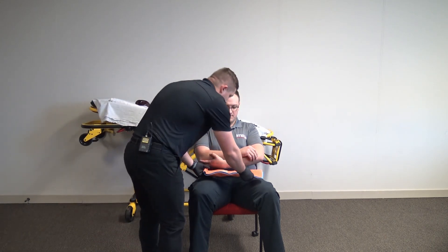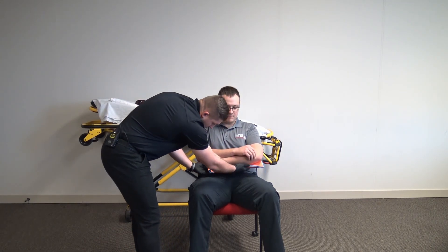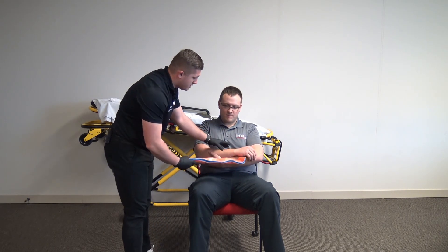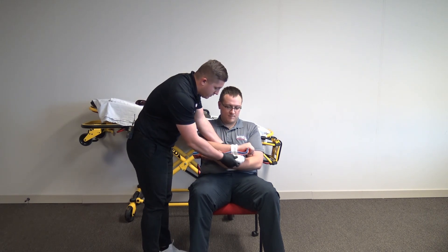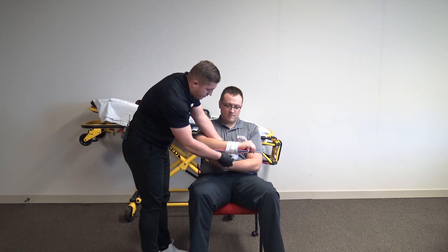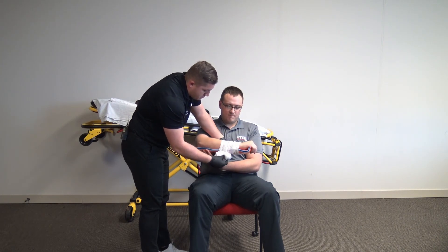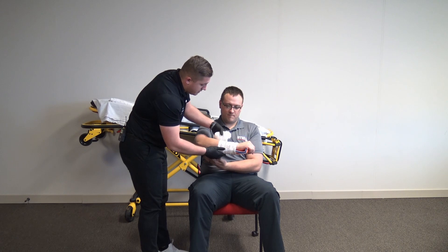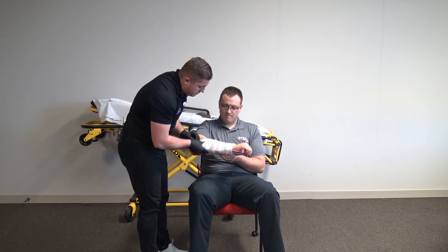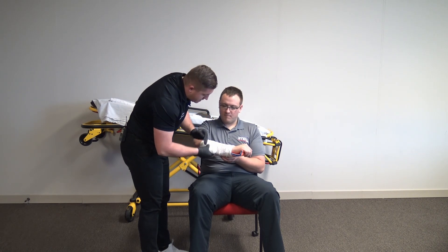I'm going to measure it on the opposite extremity to make sure it fits. I'm going to have you hold this — perfect. I'm going to secure that using a Curlex roll. It's soft, it's not going to add too much pressure, it's going to allow the extremity to swell without causing additional pain. I'm just going to softly wrap it on. The SAM splint is providing support to this broken extremity, and I'm going to be immobilizing the joint below, which would be the wrist.